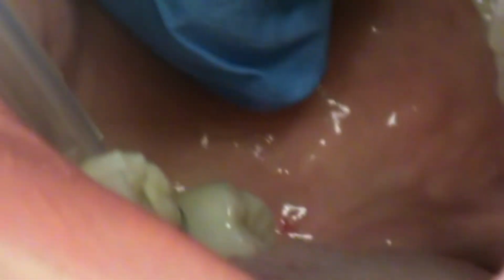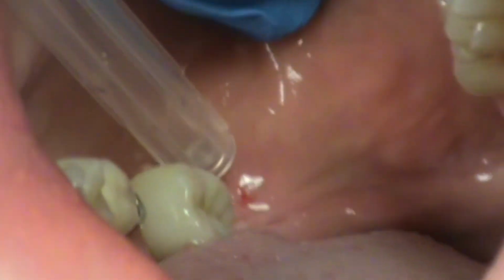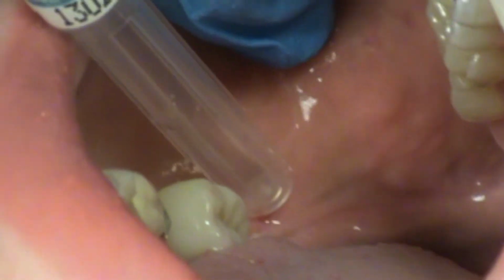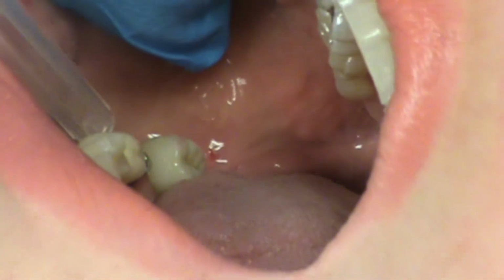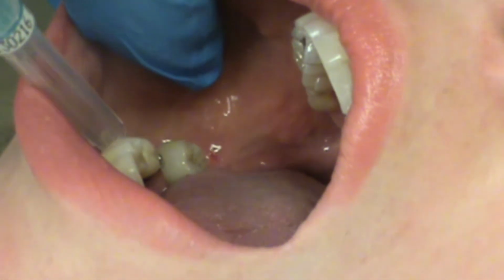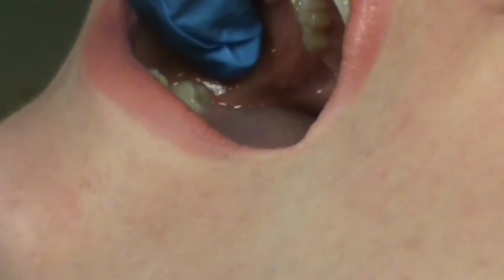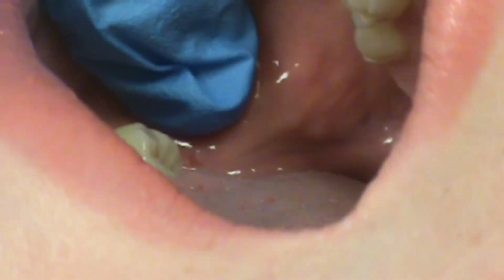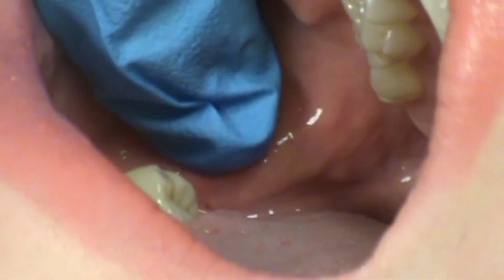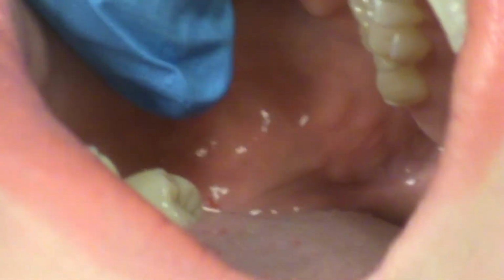Then she has a long buccal nerve that runs across the outside here, and right where that little red spot is, that would be a perfect spot to deposit the anesthetic to numb up the buccal tissue up to the end of, in her case, the implant or mesial aspect of the first molar. And you want to inject right on the lateral side of the attached gingiva, and you can see that we're getting that softer tissue. When you can deposit into softer tissue, it's better because the anesthetic can be absorbed easily.